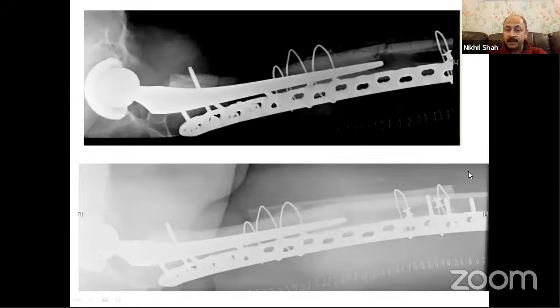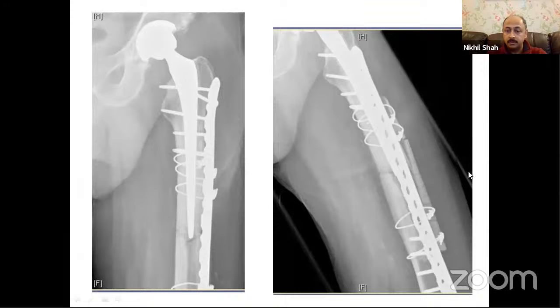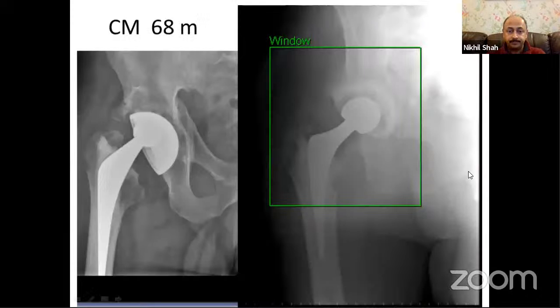And again, I've used an anterior strut, and you can see at follow-up, what happens is there is a small fracture in the strut, but the fracture is showing signs of healing. So he's not through the woods yet. This is a relatively recent case. I think it is only about 3.5 months old, and he still remains under follow-up. He has started full weight bearing. So far, the progress has been positive. So I'll keep you posted about what happens over here.